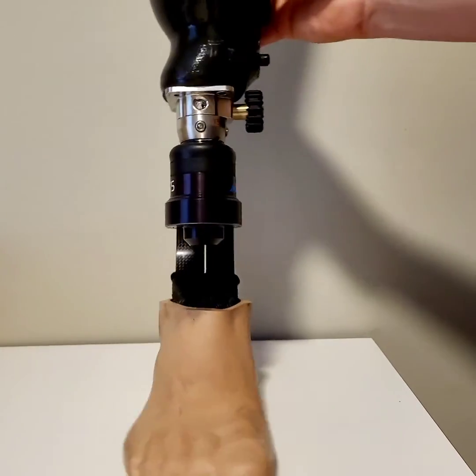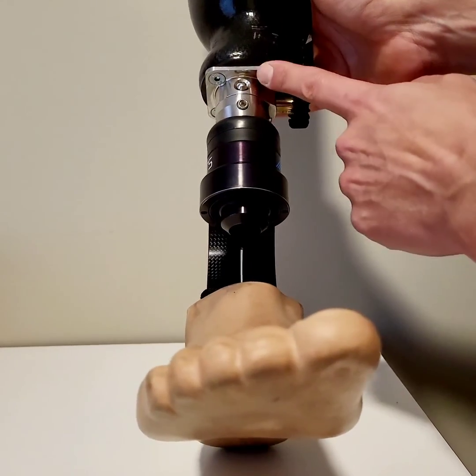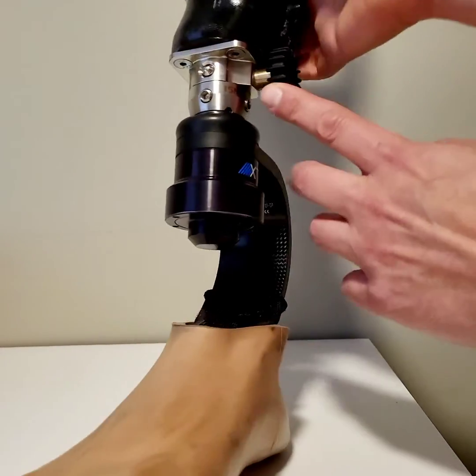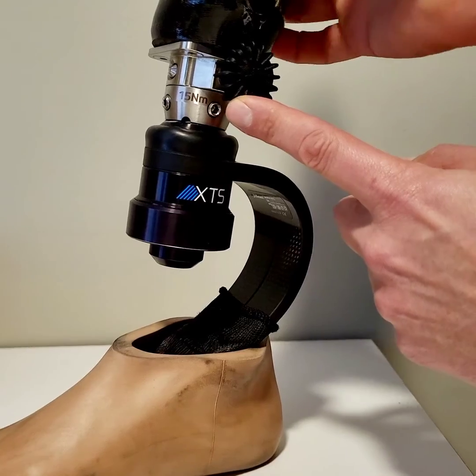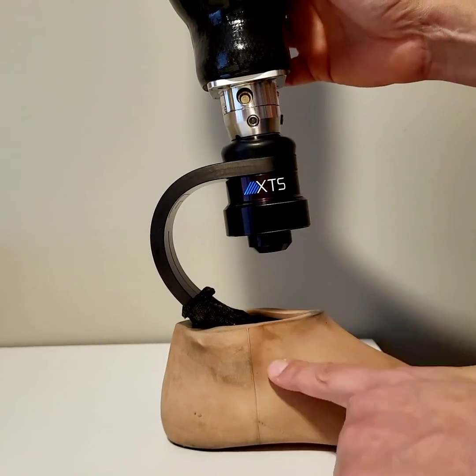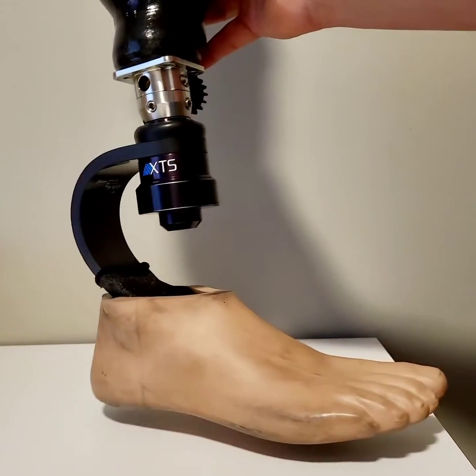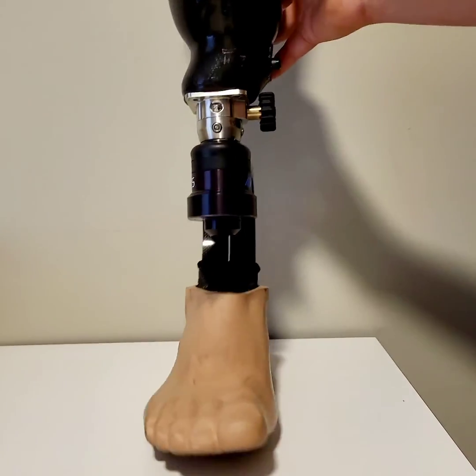So that is what I'm wearing right now. You can see it's got some offset, that plate is fixed, there's no rotation. I do have a Lindex 10 quick coupler, and then I have this eight-inch tall All Pro XTS foot. There you have it. Take care, guys.